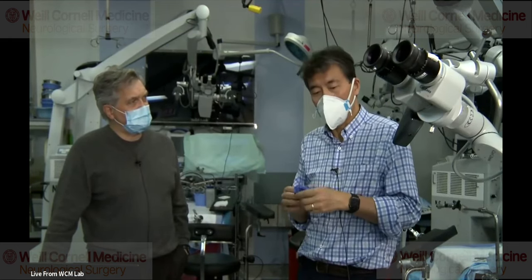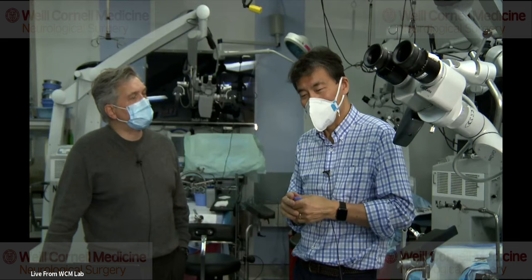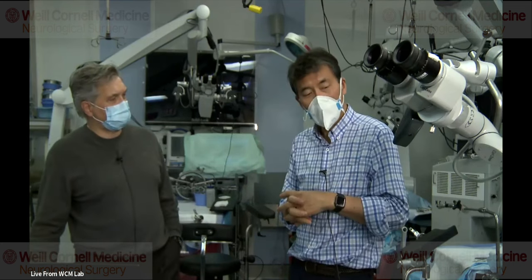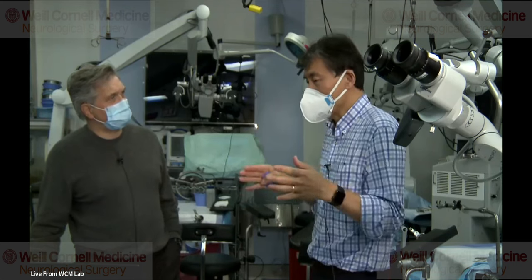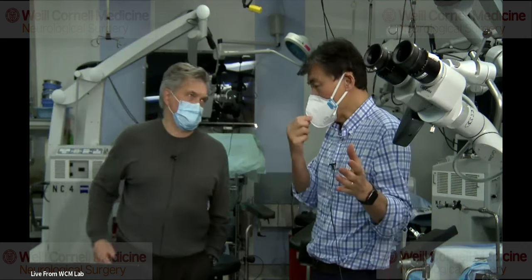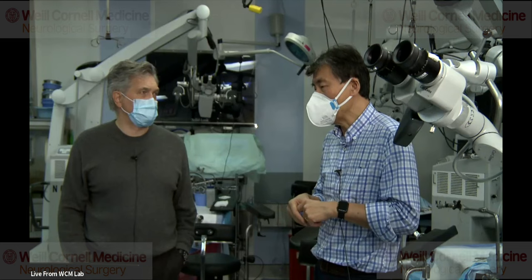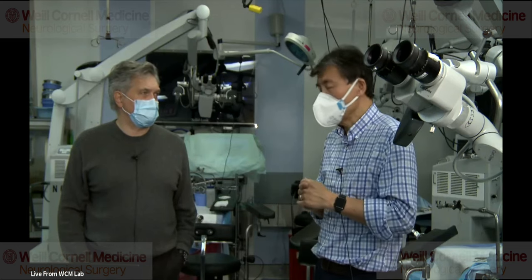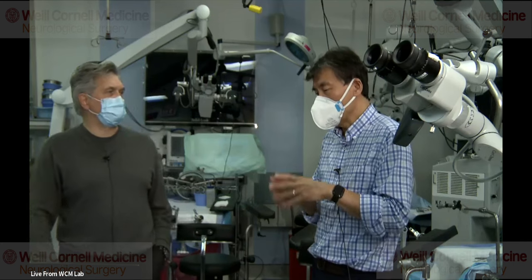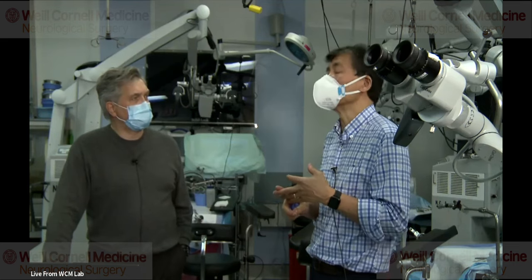I learned that technique from Teteru, I'm sorry, I'm blocking on his name right now. He is a Japanese surgeon, and he described these beautiful, meticulous ways of getting down there and dissecting it and preserving the muscles. He shows very nice post-operative MRIs compared to pre-operative MRIs, and shows that most of his muscles, when you do a dissection like that, they don't end up atrophied. Teteru Shiraishi is his name. Yeah, Shiraishi was the first one that I know of to describe the technique of preserving the muscle as much as possible. And that really minimizes the bleeding, minimizes the pain, and maximizes the ability to extend the neck postoperatively.